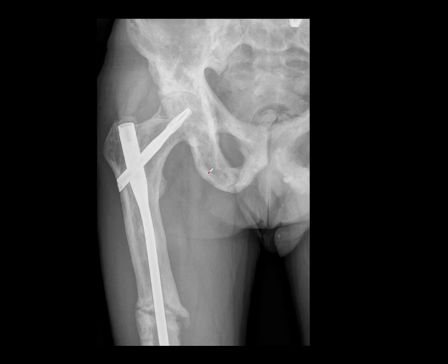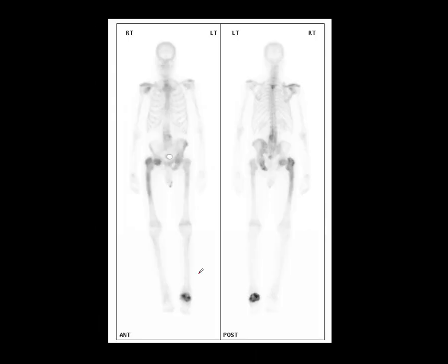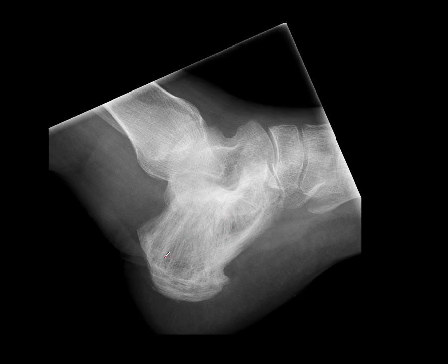On the other side, there is cortical thickening and thickening of the trabeculae, with an insufficiency fracture fixed with an intramedullary nail. In further examples, here's a patient with diffuse vertebral involvement by Paget's, extensive Paget's of the left hemipelvis, and the right femur. Paget's disease begins at an epiphysis or apophysis, and often will have what's called a flame-shaped end — a triangular shape, like a flame. There's also increased activity in the foot, with thickened trabeculae visible in the calcaneal x-ray.